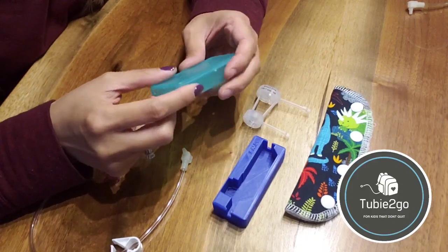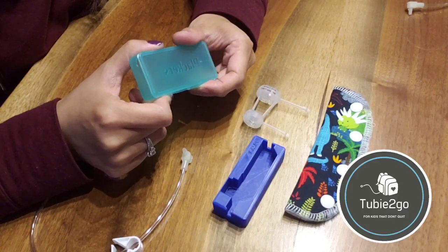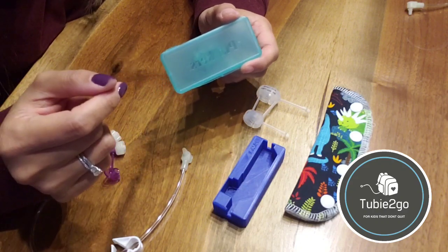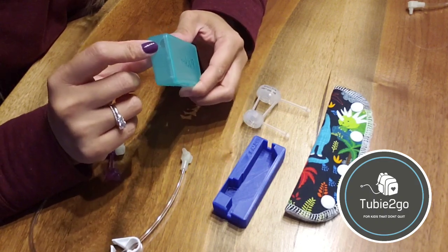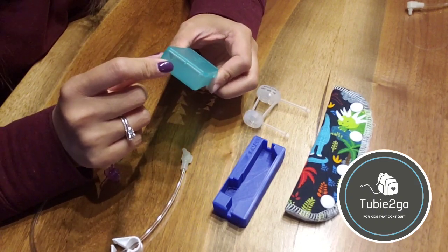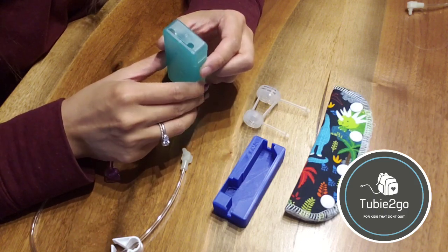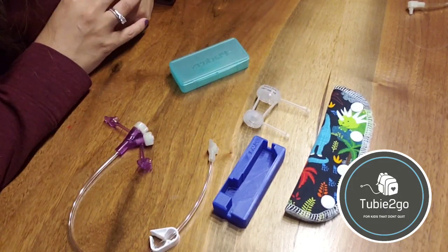Then this is just an example of a DIY option where you find a suitable container to put in your combination of ports or connections. And you're gonna have to punch out a hole, whether it's by hole punch or filing it down with a nail saw of sorts. So those are some of the options. Hopefully one of them you will find useful.